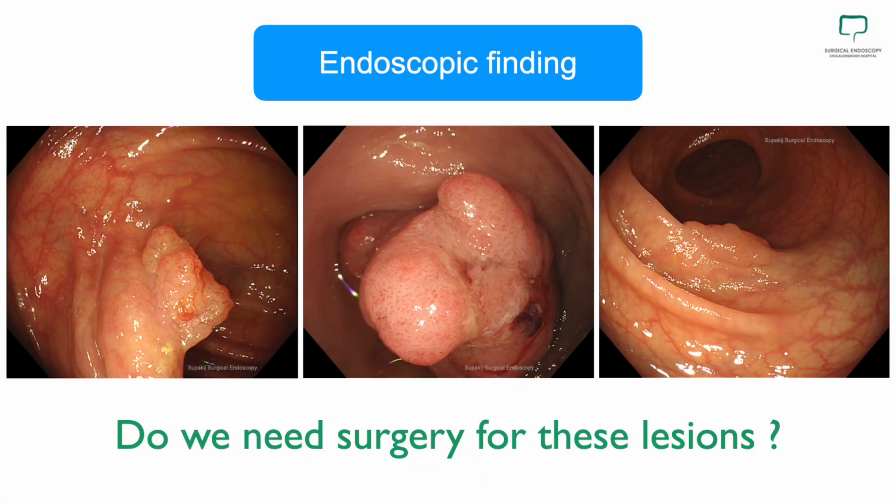How about this lesion? Do we need surgery for this lesion? Actually, all of these lesions can be resected by endoscopy with adequate oncologic resection. But we need to get an accurate preoperative diagnosis by using image-enhanced endoscopy.